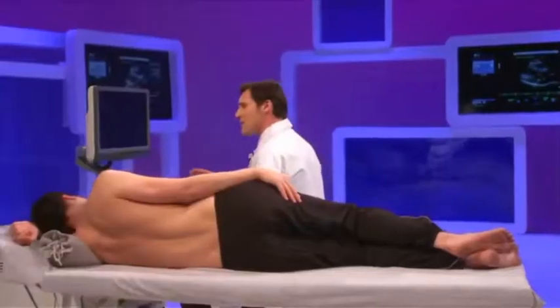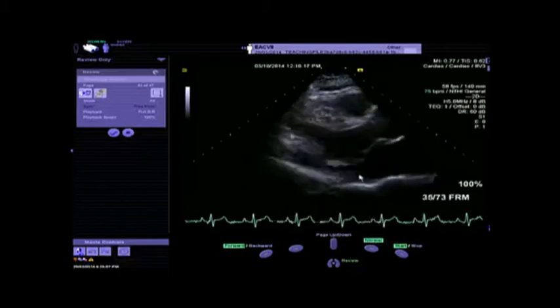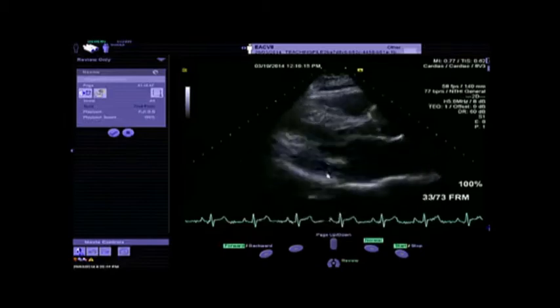And there are several criteria to be analyzed. So first, if there is some redundancy, if there are calcifications, and what scallops are involved in the disease process. And in this situation, both leaflets are involved in the disease process. The mitral annulus is dilated, and we will measure it. And also here you can see a calcification of the posterior wall, and also at the level of the posterior mitral annulus. So this means that this calcification may in some patients preclude the repair of the mitral valve.